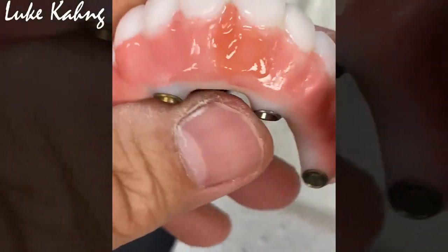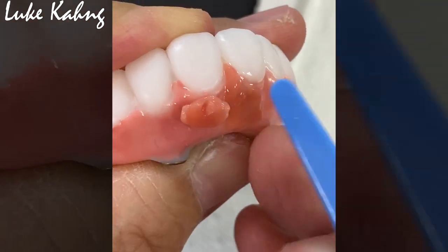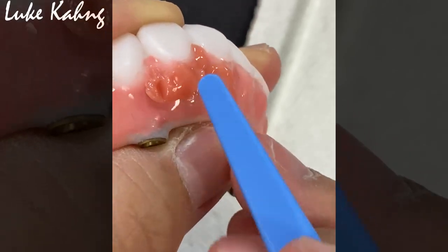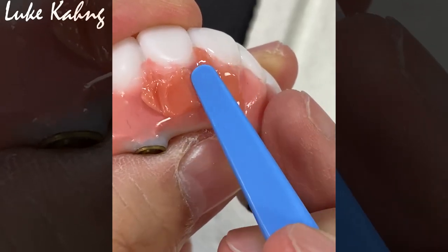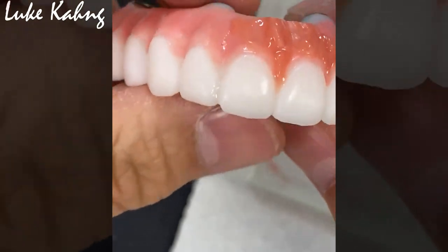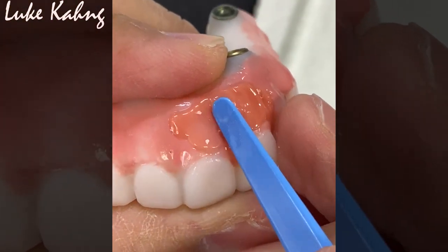And then other contour, just indicate it. And then move it. Then seal it. Okay. To make sure the proper contour, like this. So this is second time the buildup.